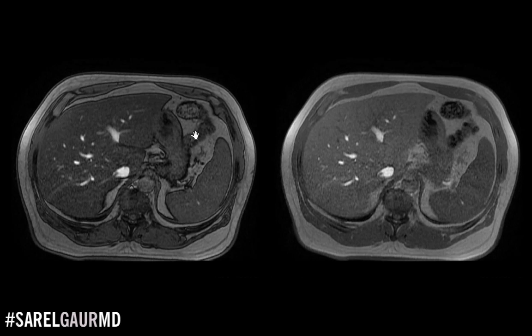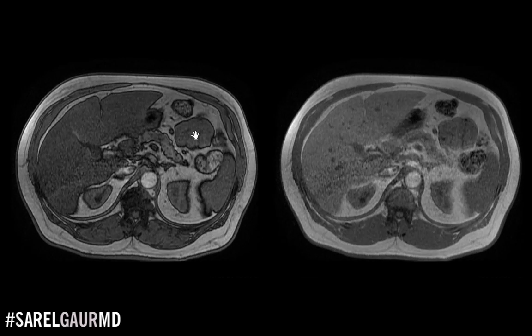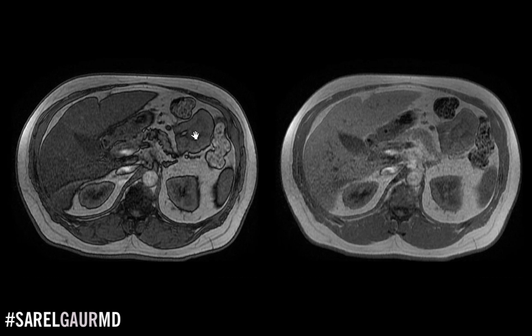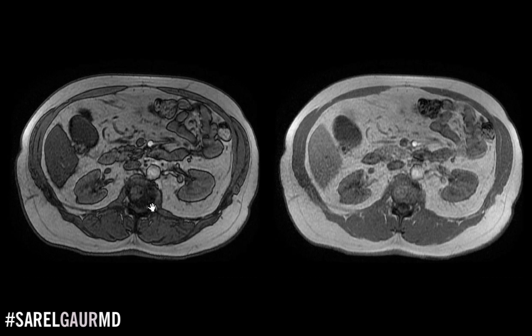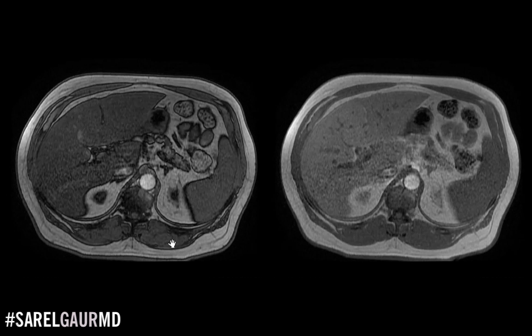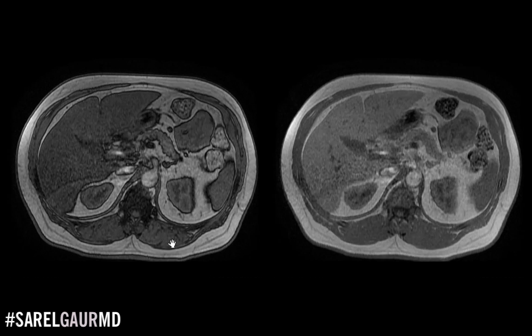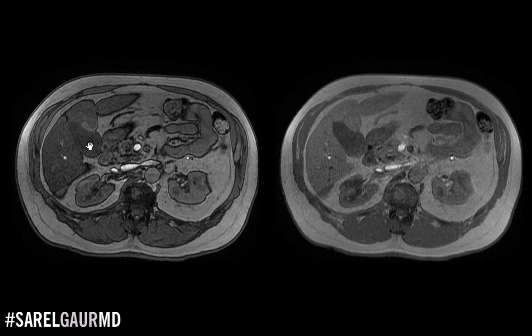Moving on to another set of images. First question: is it T1 weighted or T2 weighted? Looking at the fluid surrounding the spinal cord — the CSF — it's low in signal. So I know right away this is a T1 weighted set of images. I can double-check by looking at the gallbladder: it's dark. This confirms it's T1 weighted.